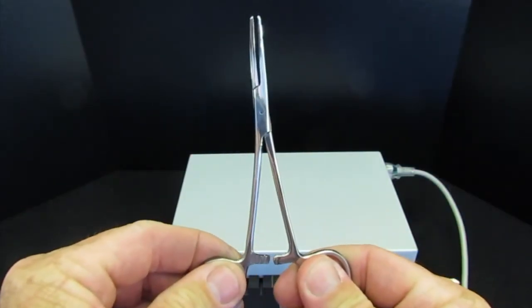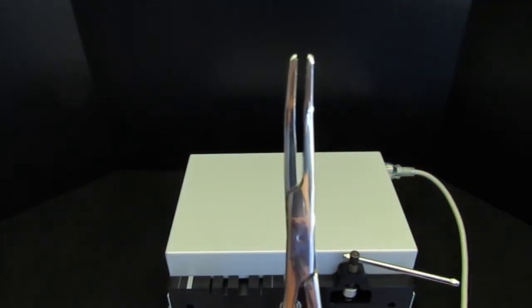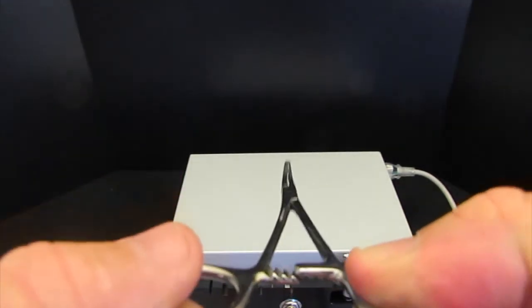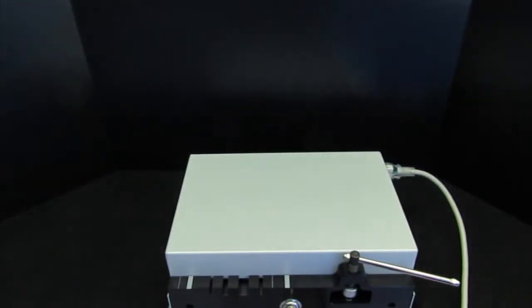To inspect the box lock for looseness, firmly grasp the ring handles in each hand. Wiggle them in opposing directions with the instrument slightly open. Notice the separation movement in the jaw and the ratchets. There should be no movement or very minimal movement in the box lock.